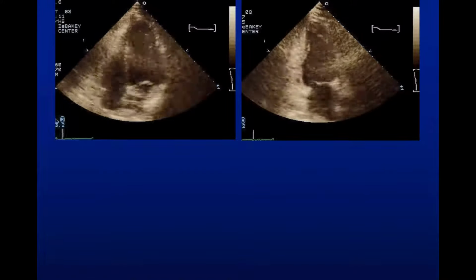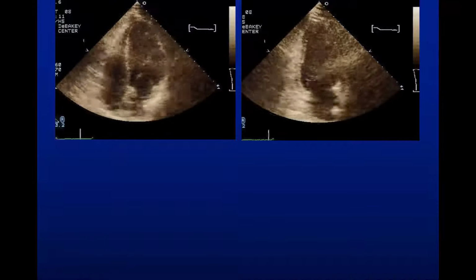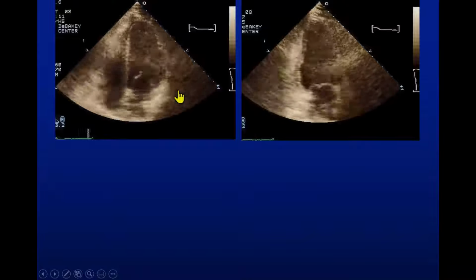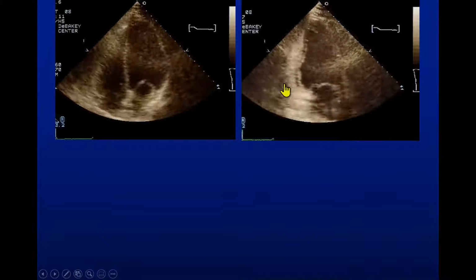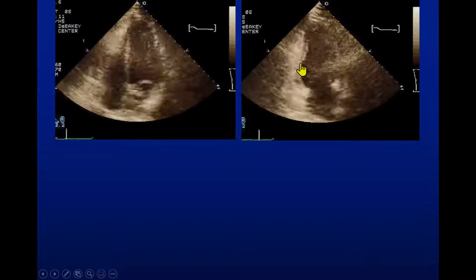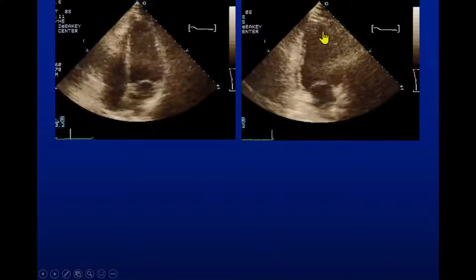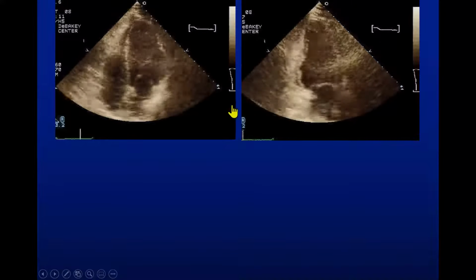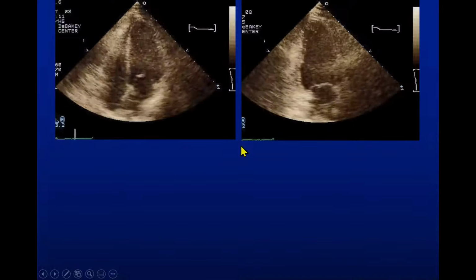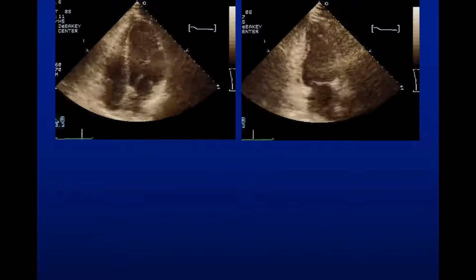Notice this case. Great case here, showing a few things. One is that ventricular function is not normal. You could see an abnormality, definitely an akinesis of the inferior wall. The others are hypokinetic. I don't see anything else really major different, right? So you can estimate ejection fraction. There is regional and global dysfunction.